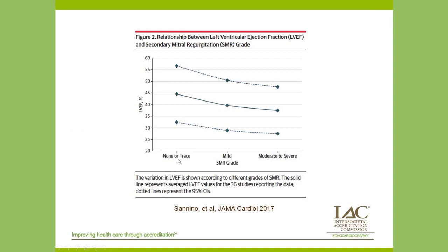Patients with no MR had an EF of about 45, mild MR, EF of 40, severe MR, EF down toward 35. This is the opposite of what you expect. We know that MR augments EF, so this curve should go this way, and it goes that way. So the implication here is that the worse the LV dysfunction, the more the MR. And this creates the conundrum of, if you fix the MR but don't fix the LV, have you done the patient any good?